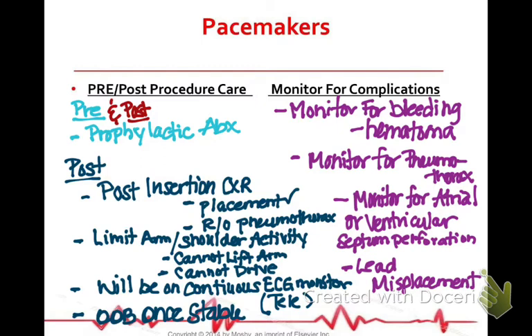And you also want to monitor for lead misplacement. How would you know if there's lead misplacement? Right. You'll see it on the monitor. There'll be irregularities.